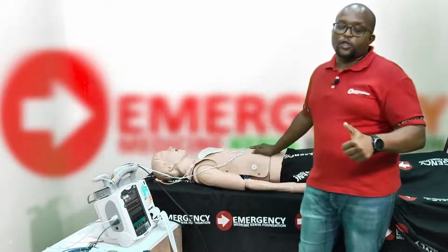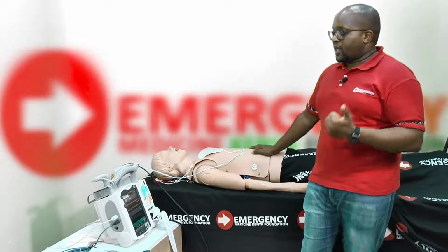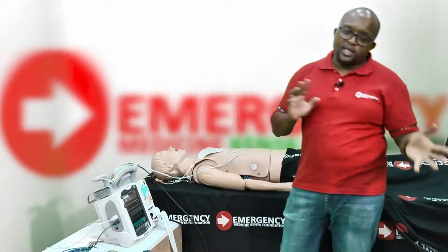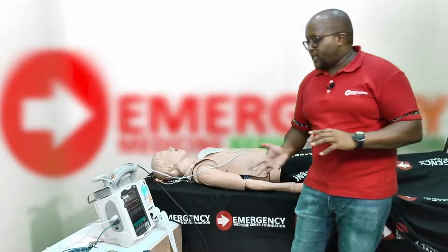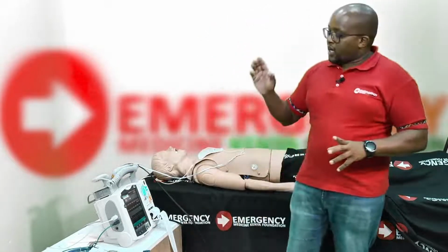In pacer mode, you want to make sure you're pacing the patient at a fixed rate in the emergency care setting. And then you'll normally follow the buttons as they are arranged, starting, you'll start your pacing, set your rate. Normally we start at 60 to 70 beats per minute, and then increase your output until every pacer spike is followed by a wide QRS complex, which is what we call electrical capture.